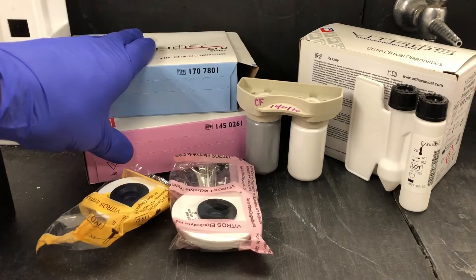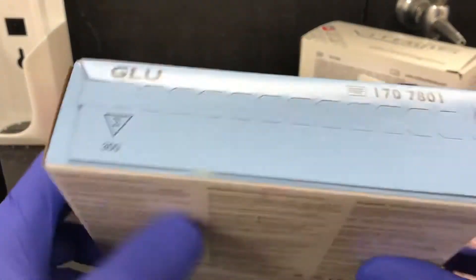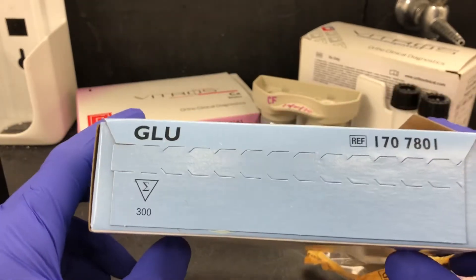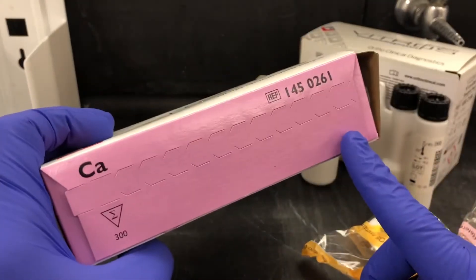Starting with the microslide, you have reagents that are refrigerated and reagents that are frozen. Reagents in the blue box are kept in the freezer, and reagents in the pink box for the microslide are refrigerated.